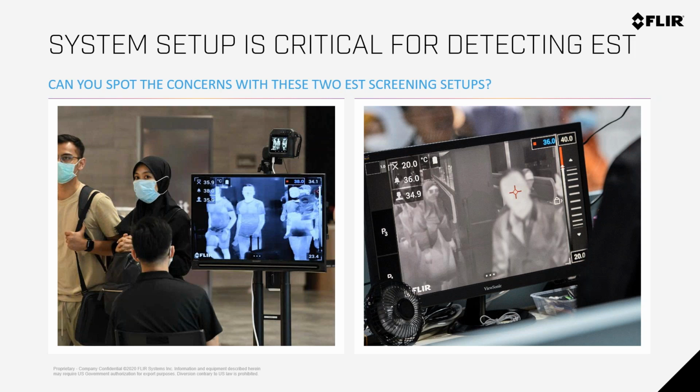And think back, if some people on the line have been married and had a wedding photographer, right? The wedding photographer, they're always making sure that the bride looks good, right? And maybe you had one of those pictures, I know I did, where the bride is standing closer to the photographer and then the groom is standing back in a distance. And just like a visual camera, a thermal camera is the same, they can only focus on one thing, right? So it's going to focus on the bride, make sure that she's pretty, make sure that she's smiling, and then in the background, kind of out of focus, but the photographer's doing it a cool way to make it look neat, you see the groom, but you can't really tell if he's smiling. You just kind of see his face, right? You just kind of see his body.